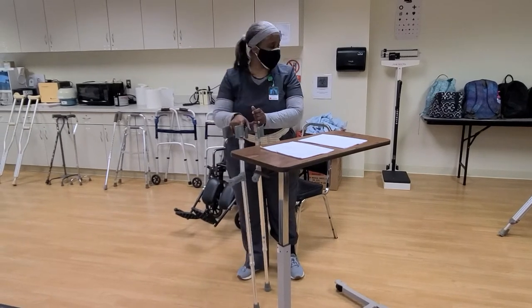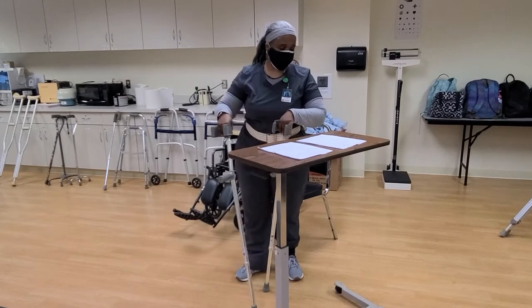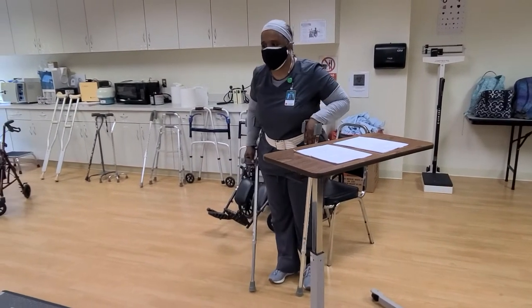These are not as stable as the crutches I just showed you. And what we're going to do when we adjust these is swing our legs through.